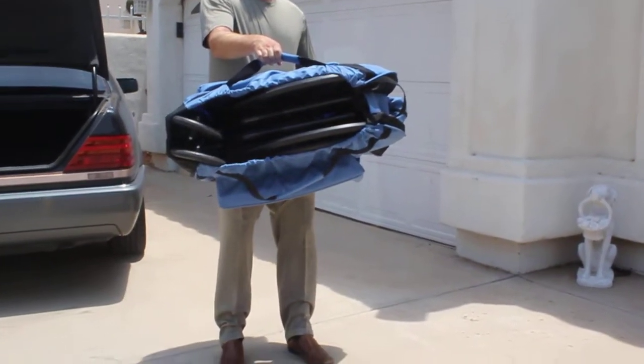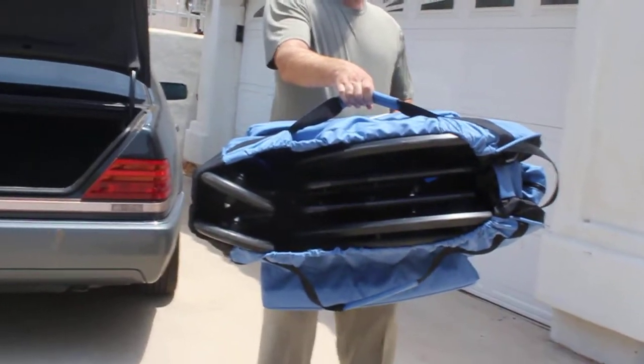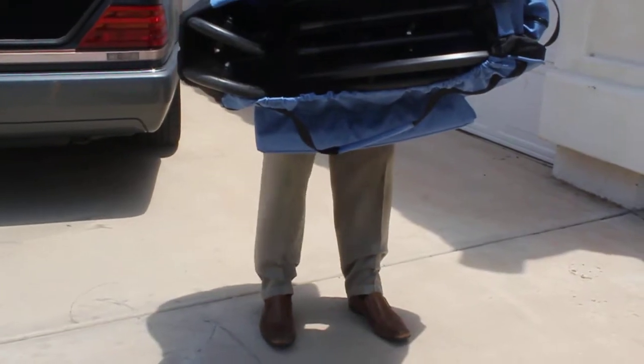Not only is it spectacular, this is made to last for the next five years minimum, and I will guarantee every single one of our wheelchair carrying cases will last at least that long. You probably will never buy another one for the rest of your life.